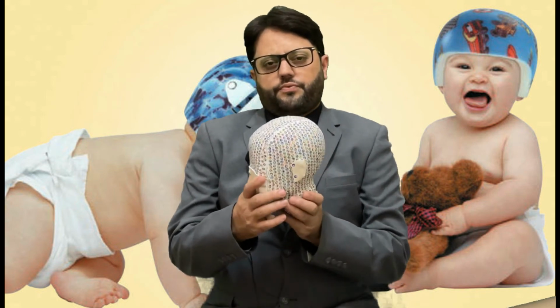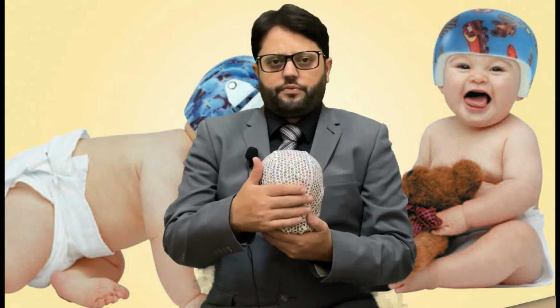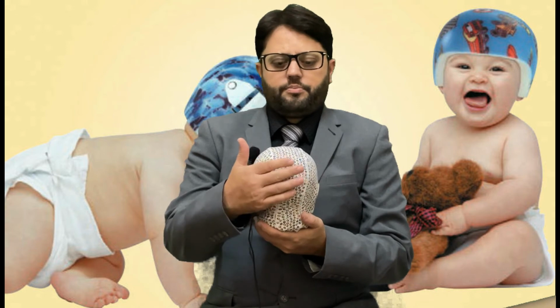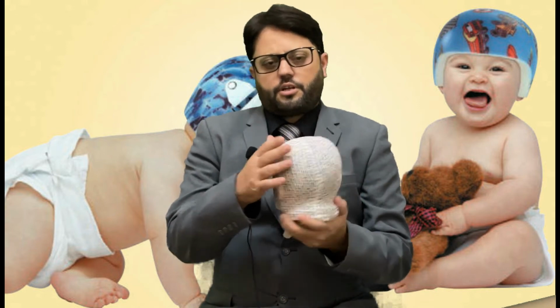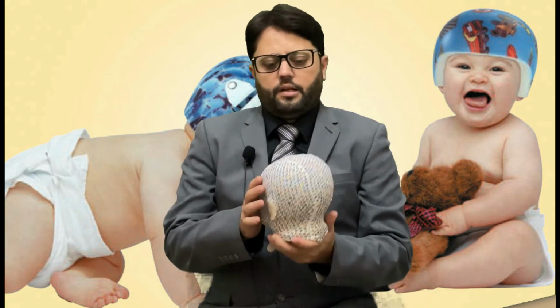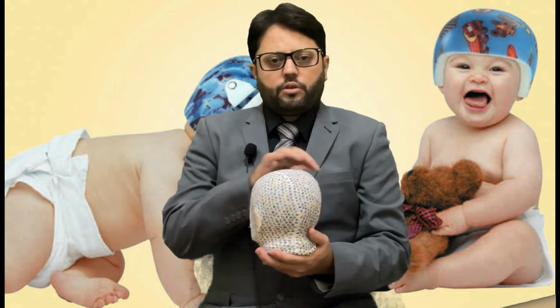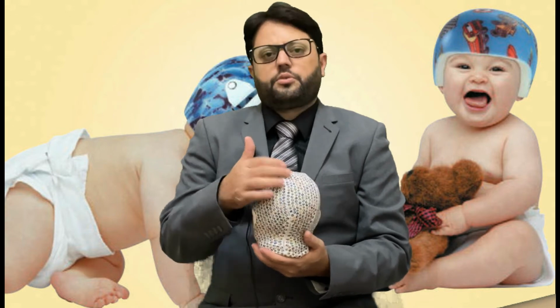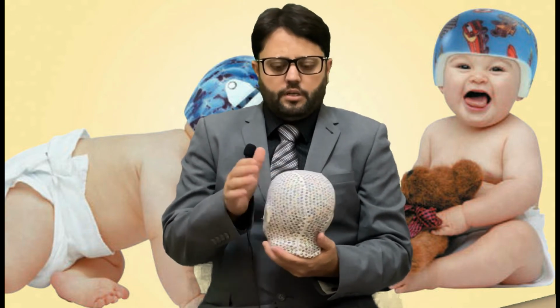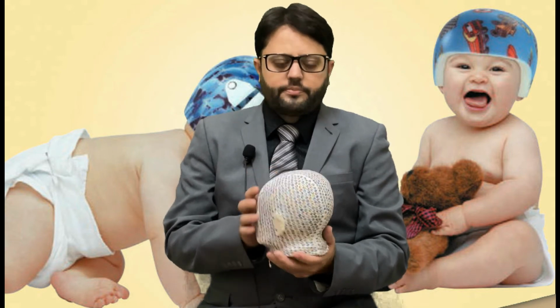One of them, if suppose this is a head, mostly we will see the posterior, the occipital area of the skull, is flatter than the front or the sides of the head. In that case, the medial lateral dimension of the head is wider as compared to the anterior posterior. The medial lateral dimension is more in such patients.